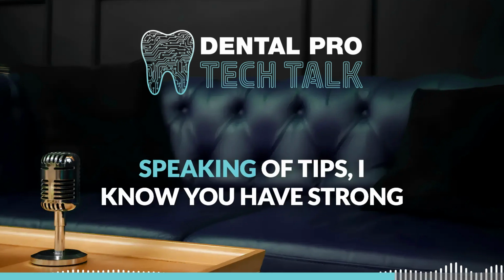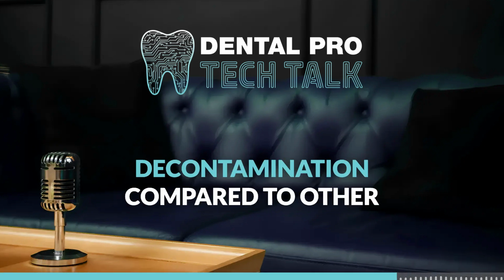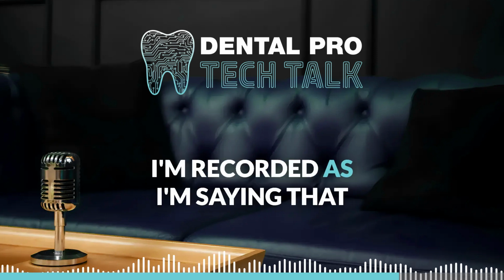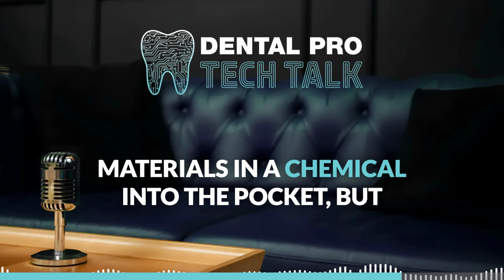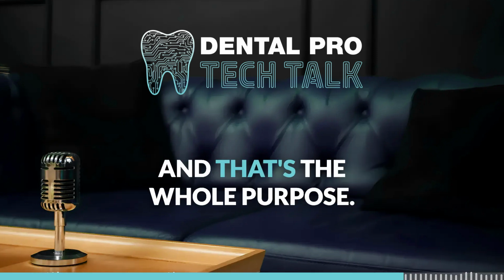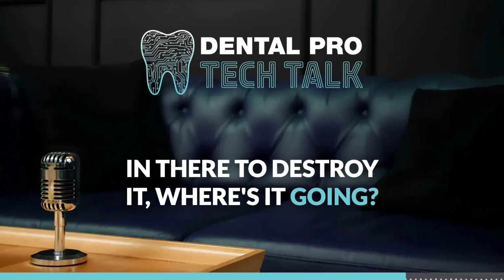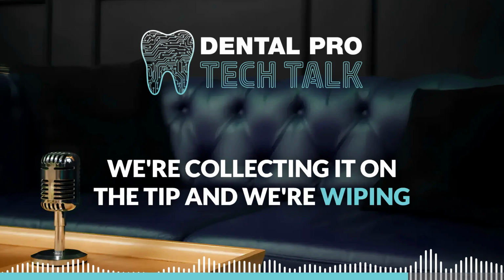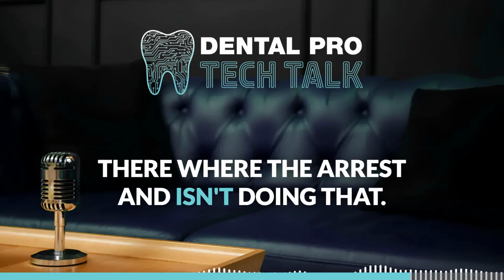That's a great tip. Speaking of tips, I know you have strong opinions about laser use for pocket decontamination compared to other treatment options like Arestin. No comparison. Yep, I'm recorded as I'm saying that. No comparison. You can place materials, a chemical, into the pocket, but it's not getting any of that stuff out of there. And that's the whole purpose. If we just have a chemical that's sitting in there to destroy it, where's it going? Whereas if the laser is attracted to it and we're collecting it on the tip and we're wiping it off the tip, we are eliminating that out of there, where the Arestin isn't doing that.